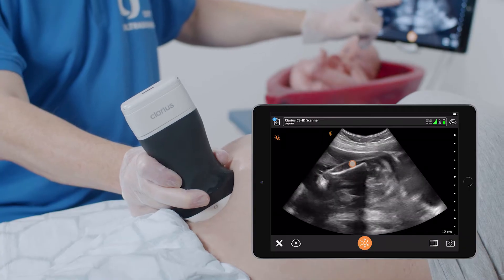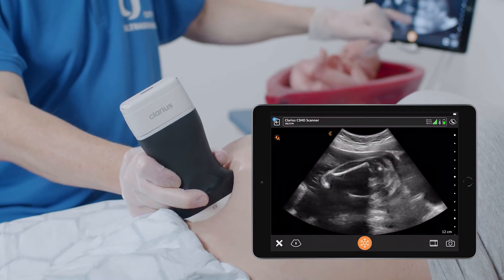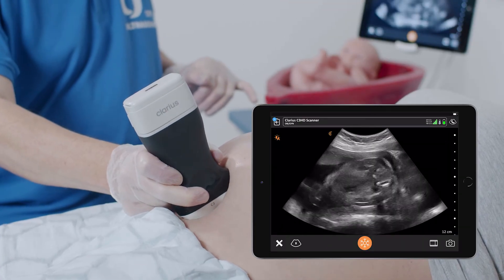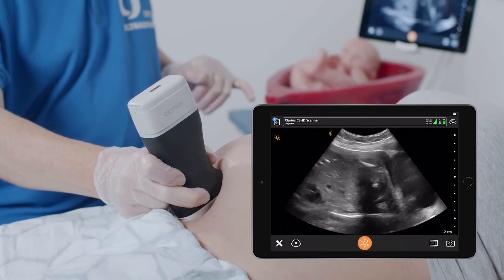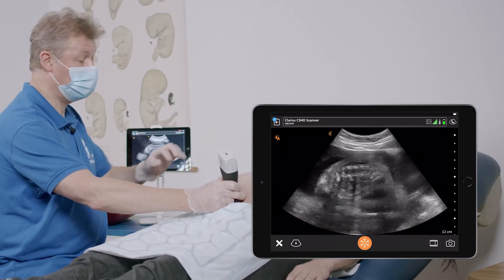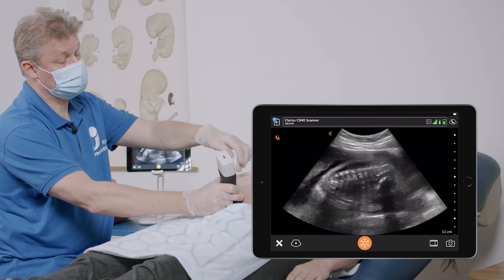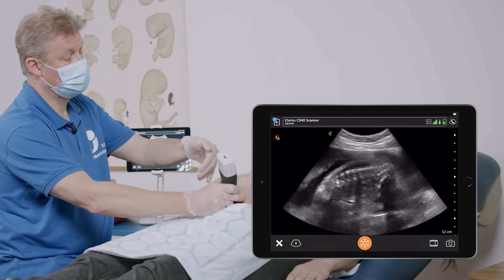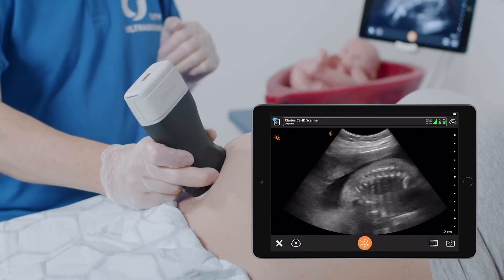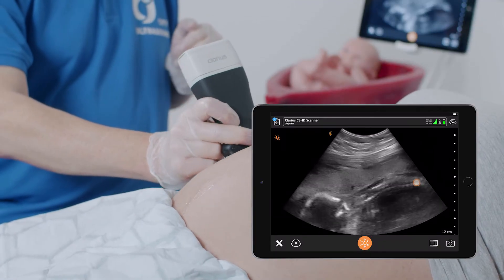I can see two bones — those are the thigh bones, femur and femur, for this baby. Moving a little bit lateral, I can also see the spine. So the position of the baby in this case is breech, and this is the baby's spine.